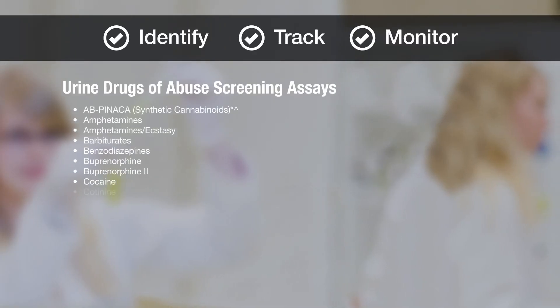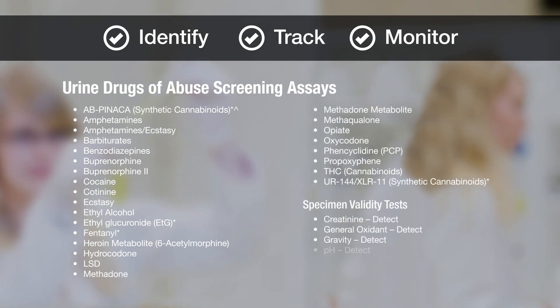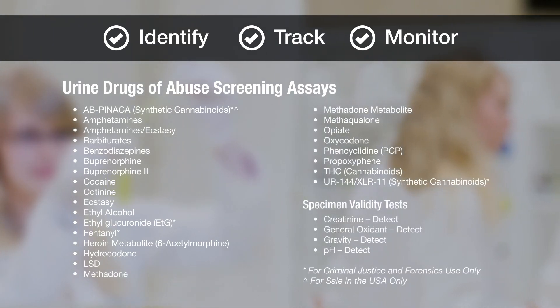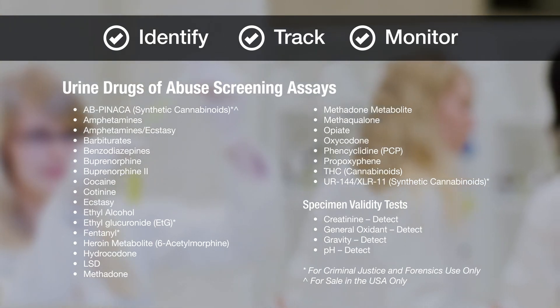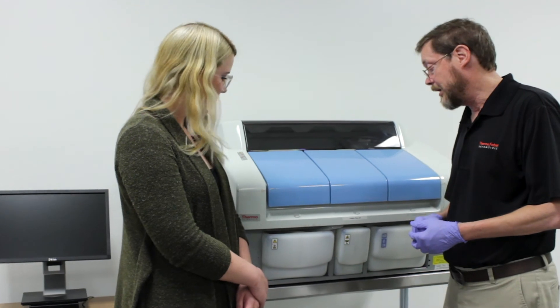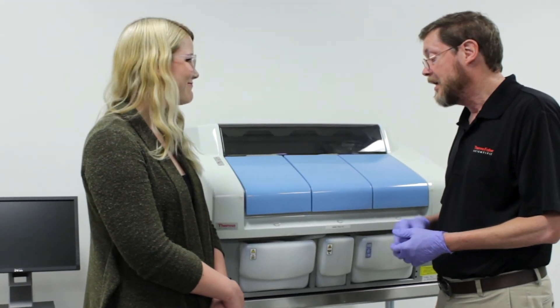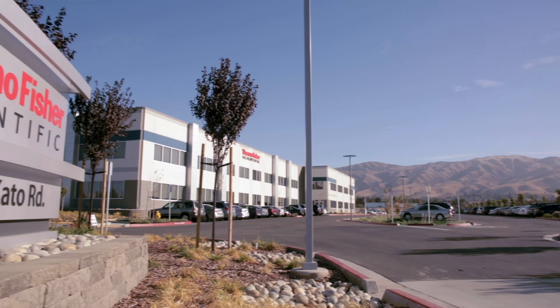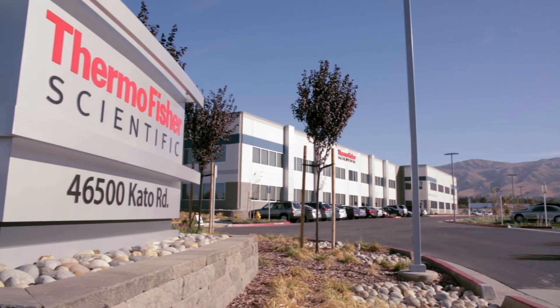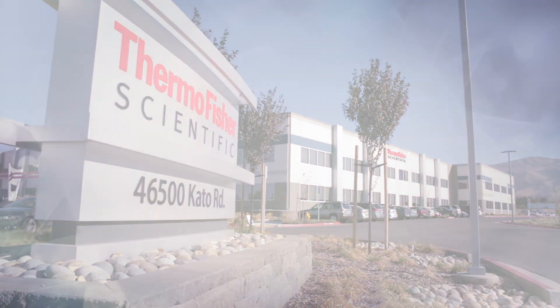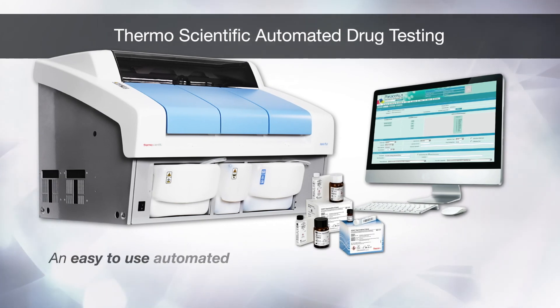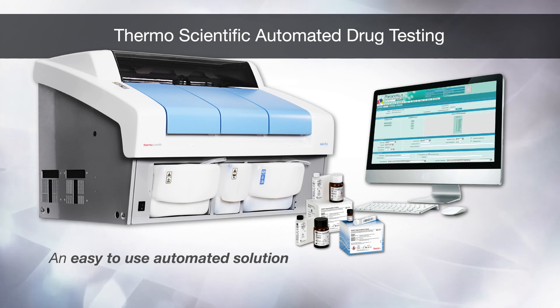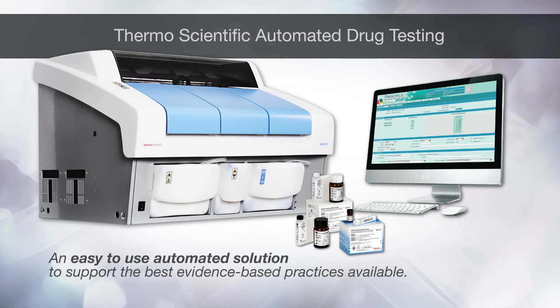With a broad menu of highly accurate tests to select from, you have the flexibility to customize and randomize testing to meet the needs of each of your participants and the changing needs of your community. Thermo Fisher Scientific offers on-site training to help you get started and ongoing support when you need it — available 24-7. At Thermo Fisher Scientific, we're dedicated to providing an easy-to-use automated drug testing process that supports the best evidence-based practices available.